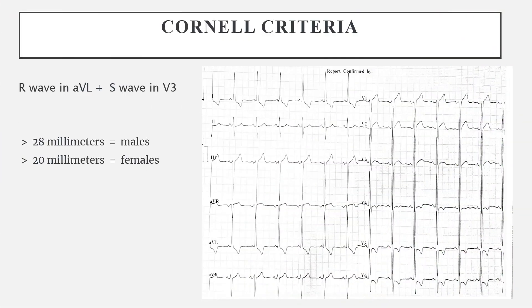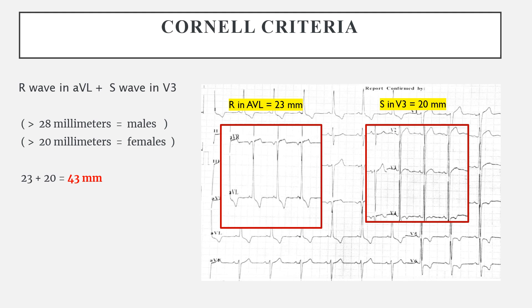Let's apply the Cornell criteria first. For that, we have to see the R wave in AVL and the S wave in V3. Combining the values for these, if it comes to more than 28 millimeters for males and 20 millimeters for females, it suggests left ventricular hypertrophy. In our ECG, the R wave in AVL was 23 mm and the S wave in V3 was 20 mm, combining to 43 mm — well above the threshold. This criteria was met.